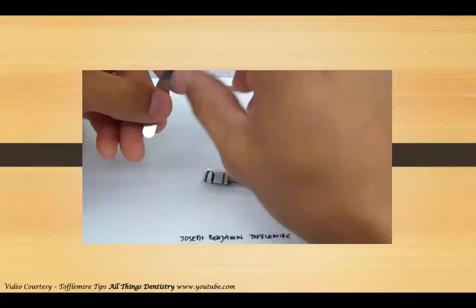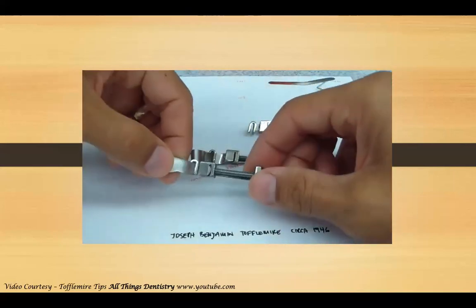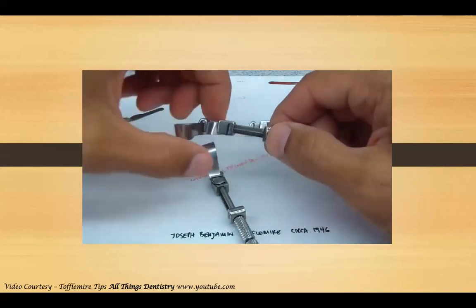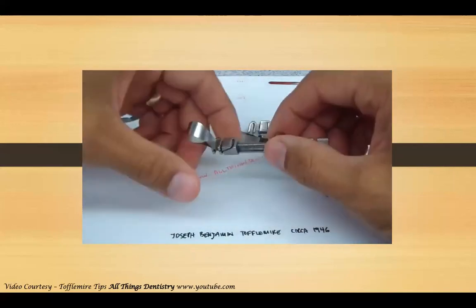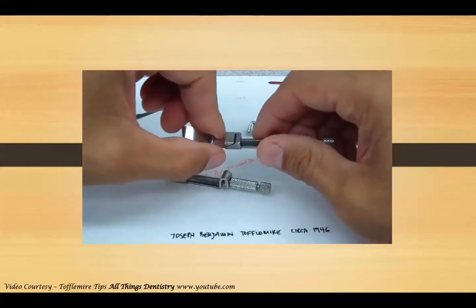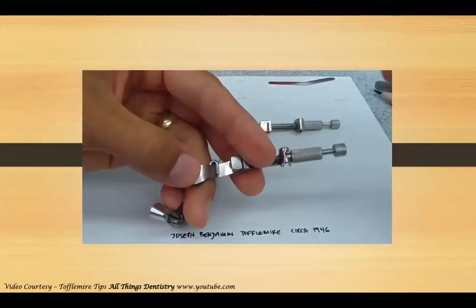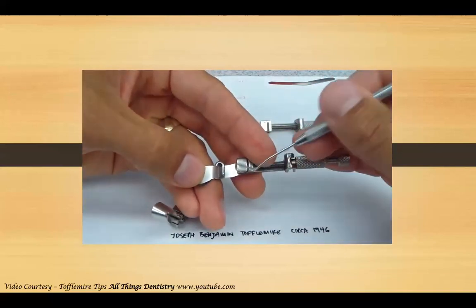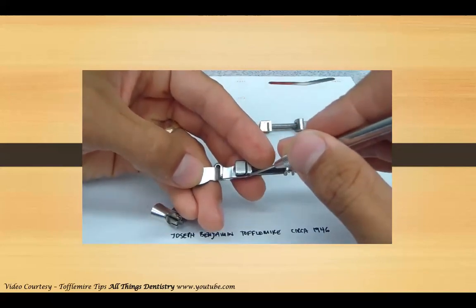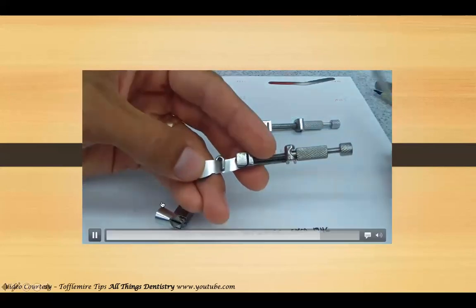Okay, so here we have the different matrices loaded up. These are the number 2 matrices in the pedo Tofflemire and in the regular Tofflemire. Let's take a look at the pedo. Occasionally, I'd receive a pedo Tofflemire. You can see that there's a little bit of band that's not covered by the holder.